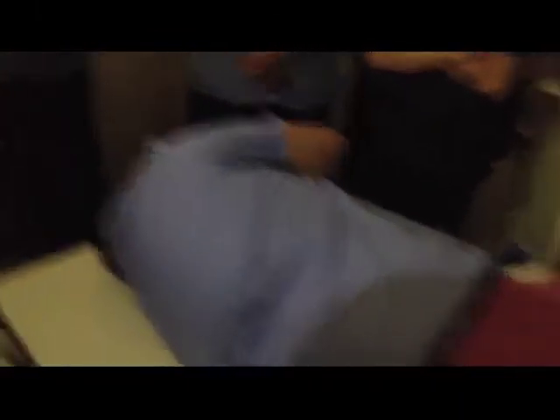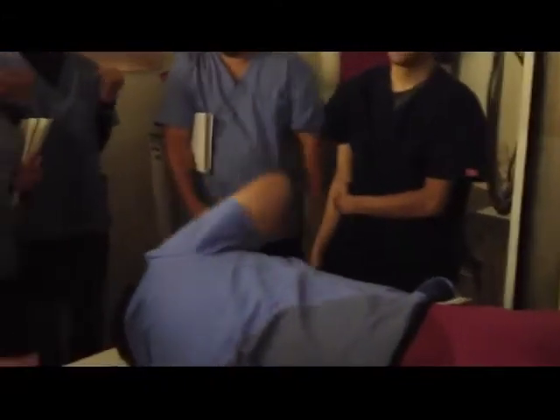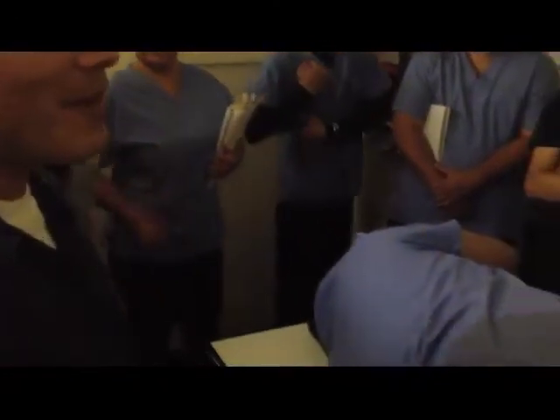Where's your elbow? Everybody, touch the elbow to your crest. Is that pretty much close? Damn, Danny. But then you get the... which is going to be like 70% of your patients — they're going to be huge. Yeah, and the light's going to be like this big.